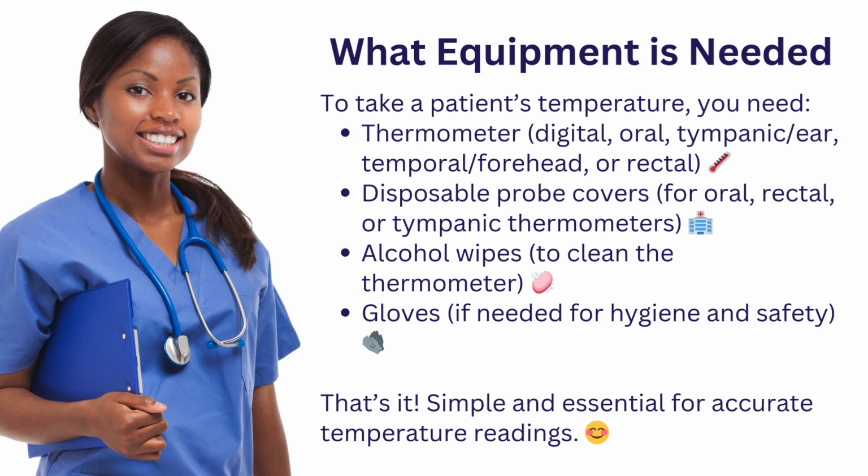All right, so let's talk about the equipment that's needed. In order for you to take a temperature, you would need a thermometer, and that's going to be based upon your place of employment. Most thermometers are going to be digital. If you have an oral/rectal thermometer, you will need a disposable probe cover. There are also covers for tympanic or ear thermometers. A cover is not usually required for a temporal or forehead thermometer. You'll also need alcohol wipes to clean the equipment, and gloves are needed for hygiene. Don't forget to wash your hands before and after taking a patient's temperature.